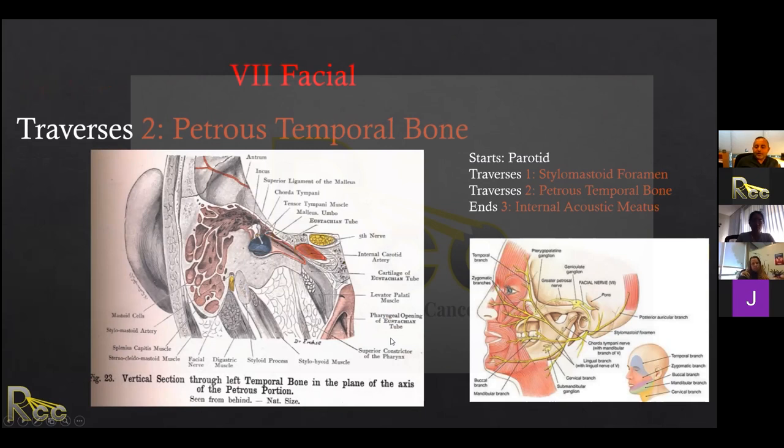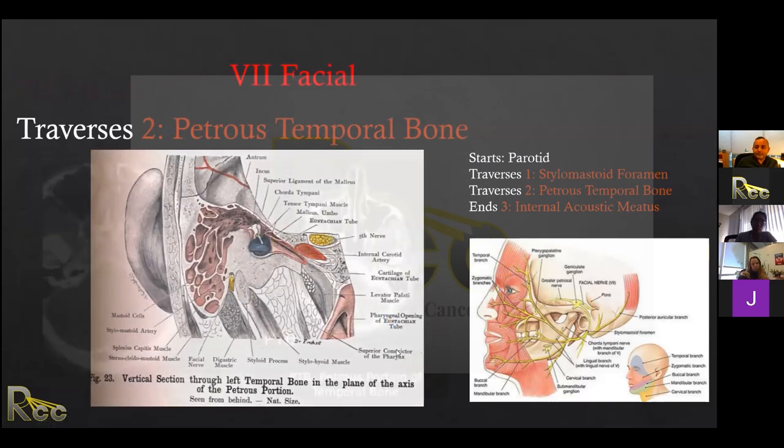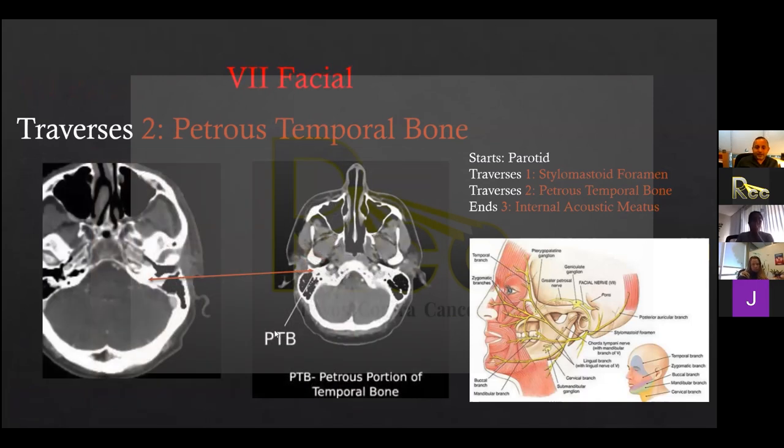What's hard in these patients is tracing this further as it goes into the petrous part of the temporal bone and the IAC. So the decision to treat zone one is super easy. It's the zone two, three decisions that become hard, because now you're talking about giving somebody hearing loss in these patients. So again, just showing you some 3D pictures from Netter here, and again then showing you some CT slices here.